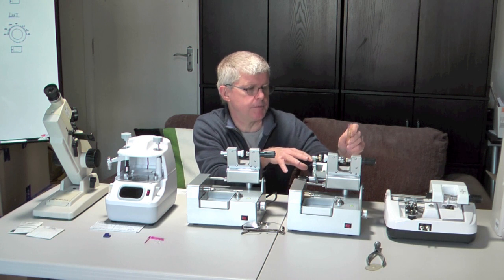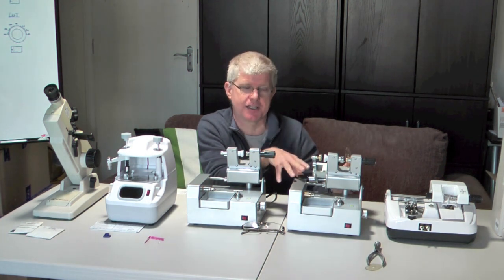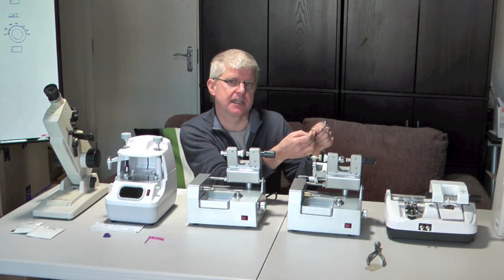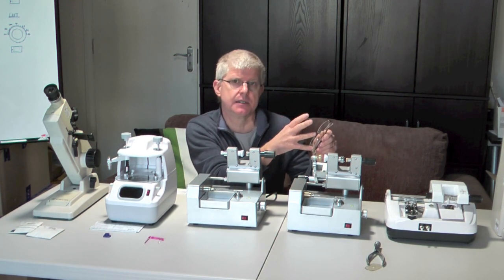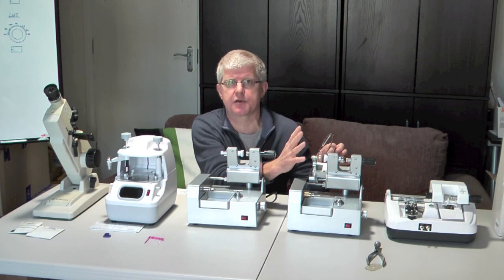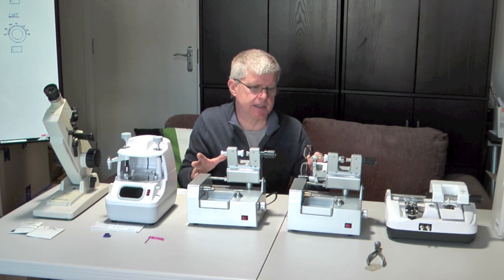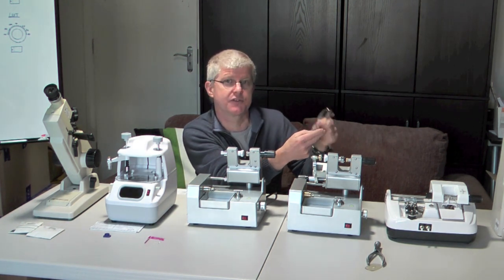We put the former in there and the lens — which has already been blocked up — in there, and this machine will then flat-edge the lens. The best frames to use in these sorts of places are the ones that have a nylon cord that holds the lens in. They are much easier to glaze than a full frame, which requires a bevel. The bevel is far more difficult to achieve properly and needs more sophisticated equipment. If we keep it simple and use these nylon cord frames, we can keep the equipment nice and basic — that's what I would recommend.